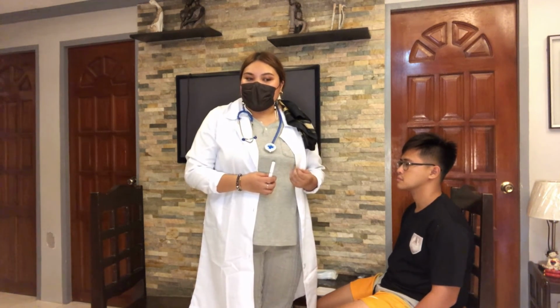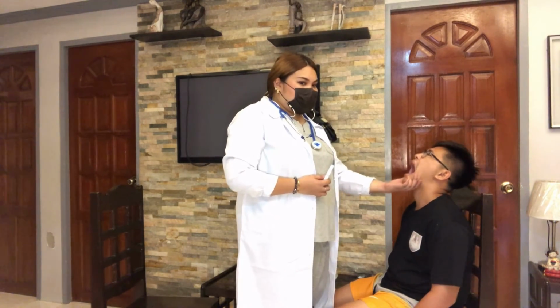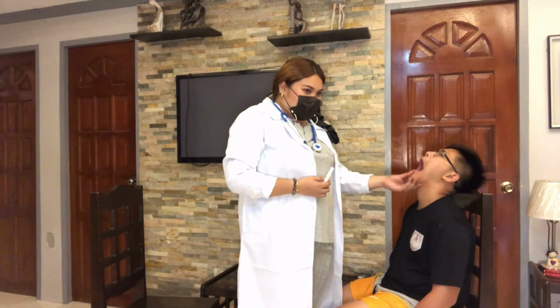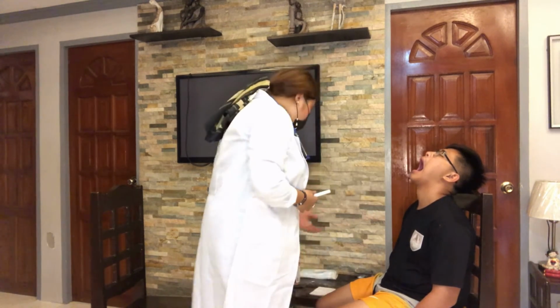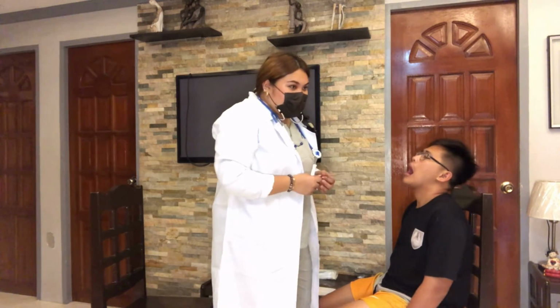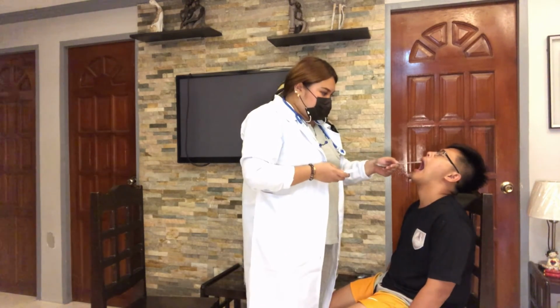Then ask the client to open the mouth widely and tilt the head backward. Then use the tongue depressor. Then use the pen light for visualization.